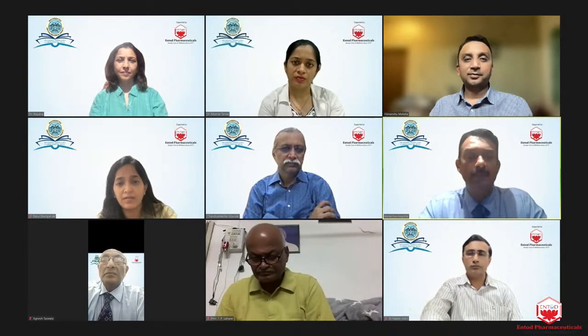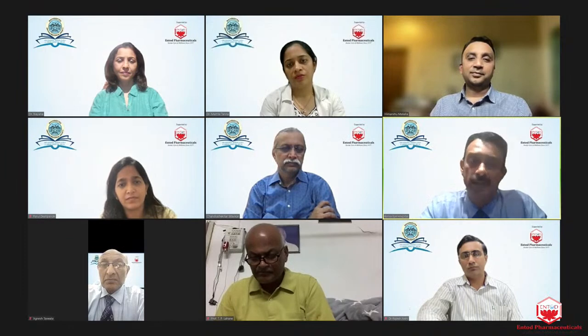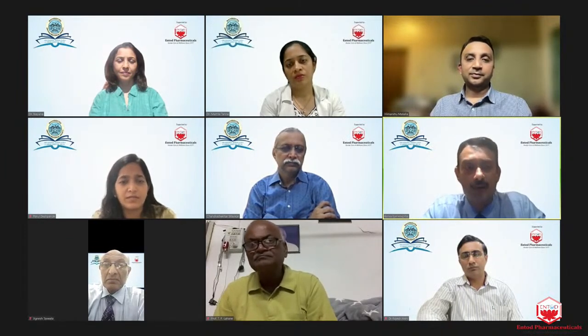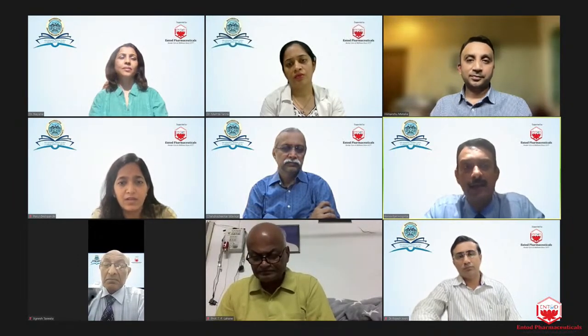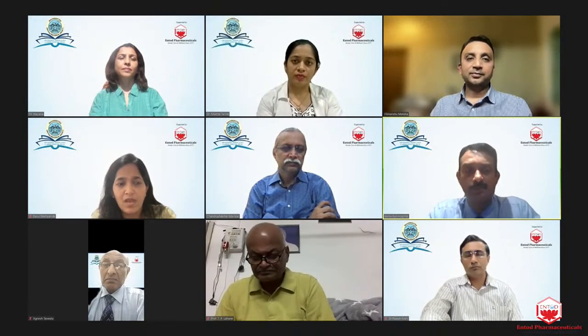But in today's time, there are a lot of formulas like the Holladay KC formula and the Kane KC formula. But today, Barrett True K measured has worked beautifully well. I have a series of around 30 cases, but these are mild cases, grade 1, less than 48 diopters, where it has done extremely well.